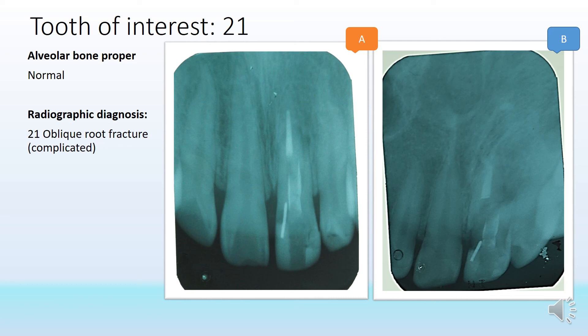The alveolar bone proper appears largely normal, which reconfirms this is likely recent trauma. The radiographic diagnosis is that 2-1 has an oblique root fracture. Had the tooth been radiographed after a couple of days, more radio-opacity or radiolucency at the apex indicating bone activity would be visible. Since this radiograph was taken immediately after fracture or in an acute phase, there are minimal changes at the apex, but the oblique fracture is definite. The tooth is a previously root canal treated tooth, so the tooth itself may not be painful, though the patient may have pain due to trauma to adjacent tissues.